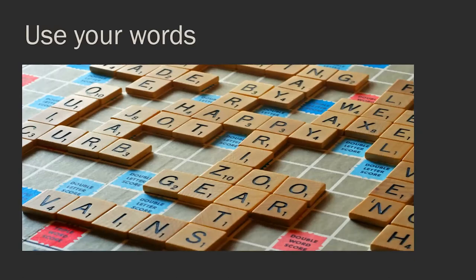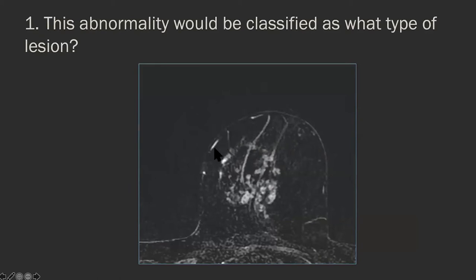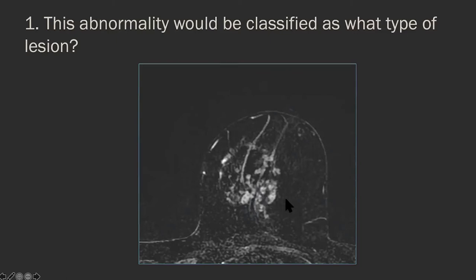Now we'll bring up some polls to see if you've learned how to apply the terminology. First poll: this lesion here — focus, mass, or non-mass enhancement? The vast majority, 91%, got that this was non-mass enhancement. This is non-mass enhancement — there are lots of areas of non-enhancing parenchyma in between. I would probably call this regional and heterogeneous — it could even move towards clumped perhaps. There is more than a few shades of grey when reading these.